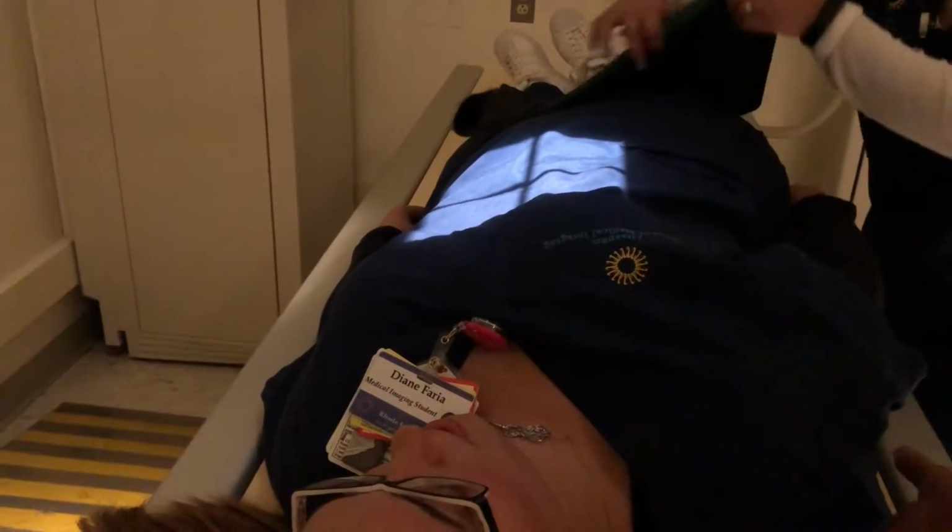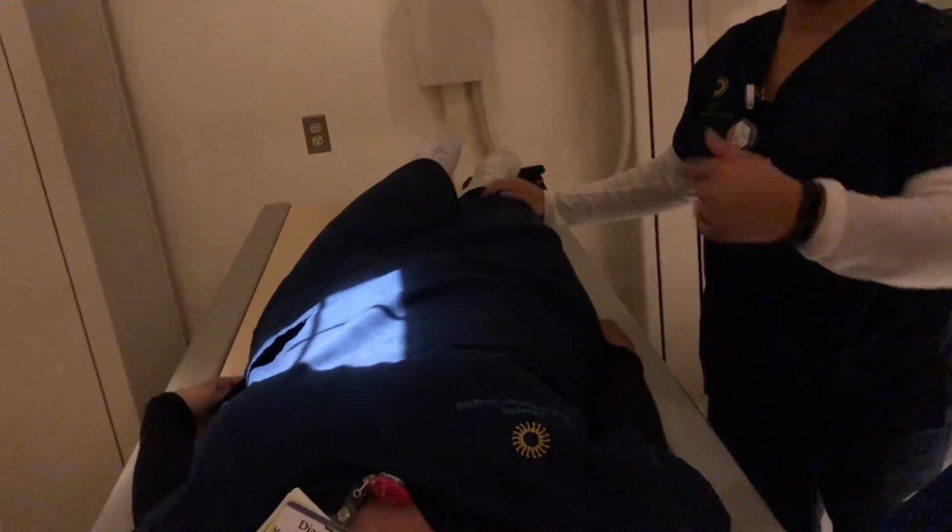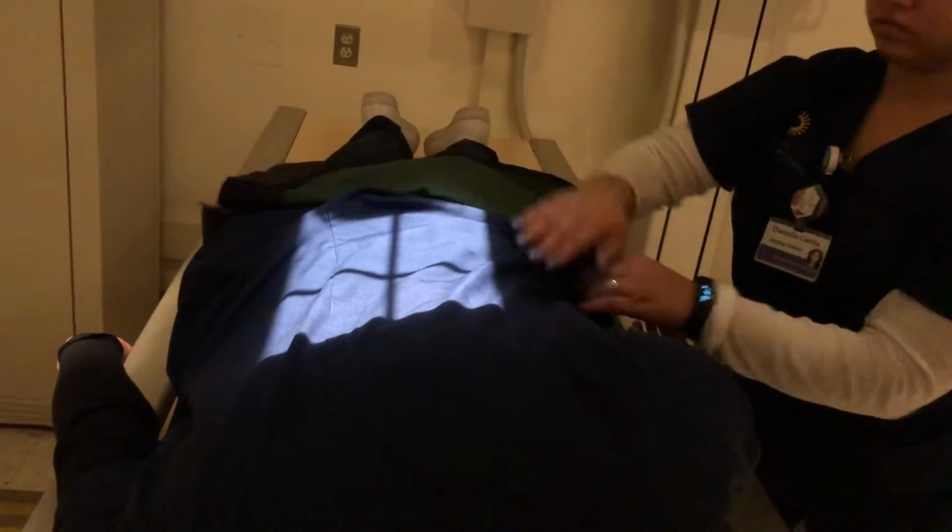Our next image is going to be an RAO. So we're going to bring the patient into an RAO position. All the way around. All the way, keep going. So our obliquity for the RAO is between 40 and 70. So 70 would be for a hypersthenic type patient, and 40 would be for an asthenic type patient. So again, she's a sthenic type patient, so we're going to be centering on L1-2.